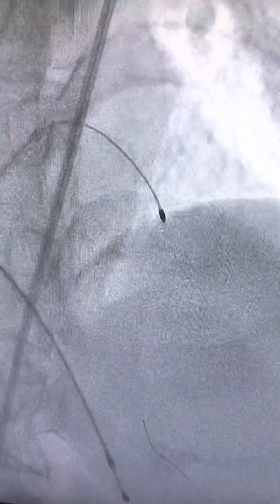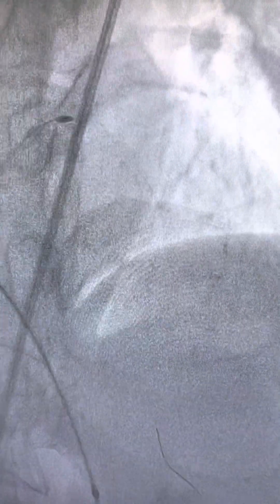I'm doing multiple passes. When this rotating burr crosses the calcific coronary segment, it breaks the coronary calcium into pieces that are very small — even smaller than red blood cells. These fragmented calcium deposits are then engulfed by macrophages, clearing them from the system.